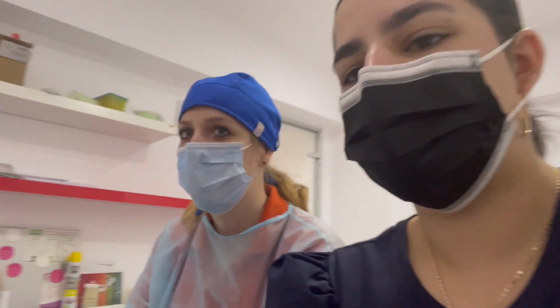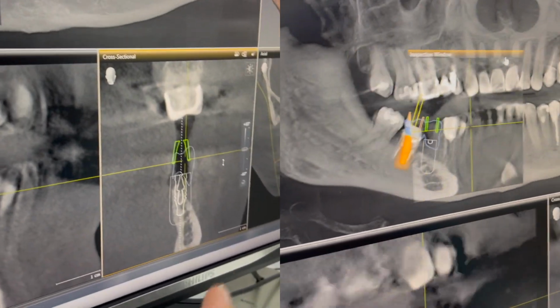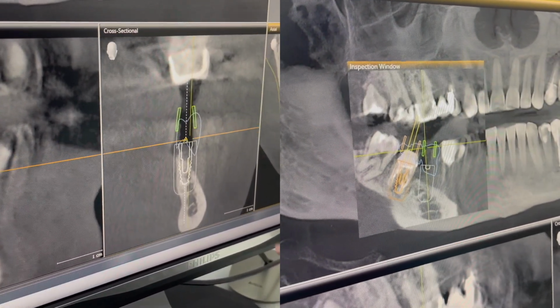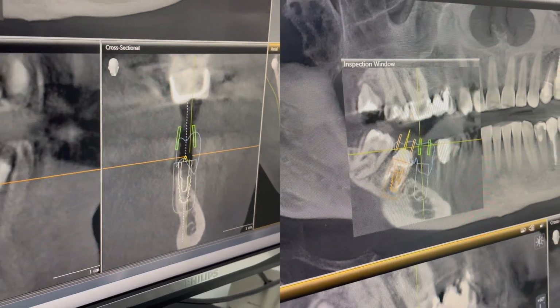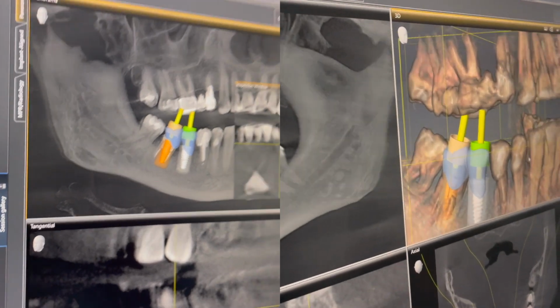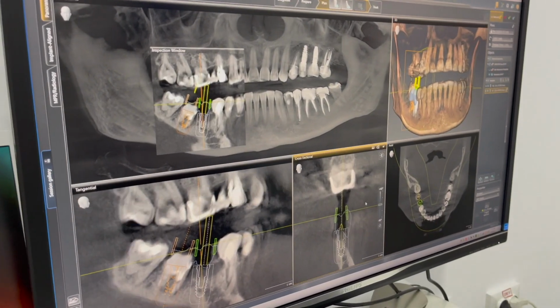So we have to make sure that when we place the implants, they are in the middle of the bone and with enough distance from the mandibular canal, because otherwise it wouldn't be good. So for example, we have to find the position for the implants like that, and of course the implantologist, aka my mother, has to check it, and when she says it's the good position, then Dr. Amalia can export it, and we're gonna go to the in-lab part.